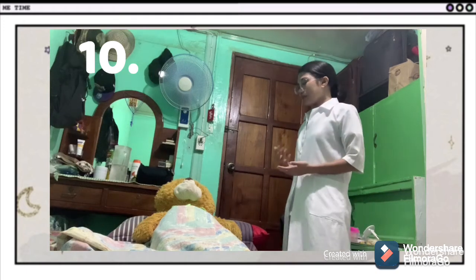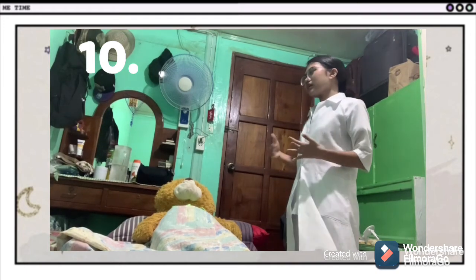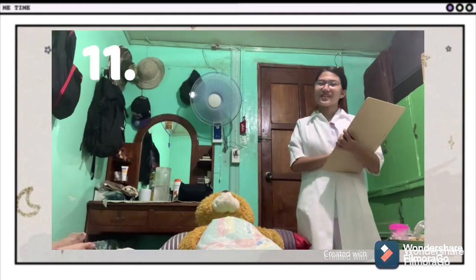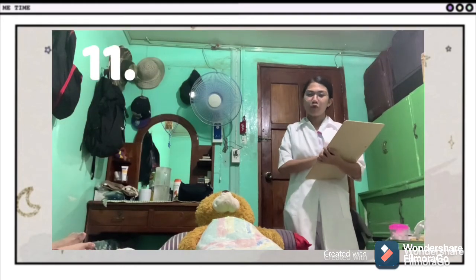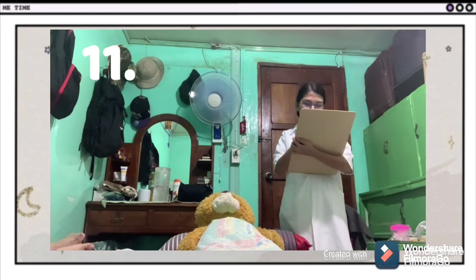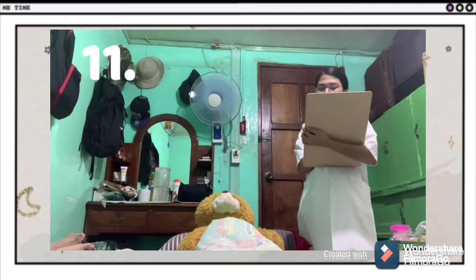Instruct the client to drink extra fluid and warn that there may be mild burning with the first few voidings. Remind the client of the expected voiding time. Lastly, document the time of removal and the time by which the client should have the next voiding. A careful record is important. Reporting and recording of information about the procedure must be accurate and timely for continuity of care.